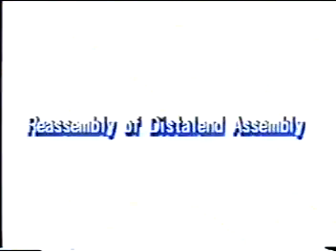Reassemble. Let us explain how to assemble DAT, distal end tip assembly. These are parts composing DAT.